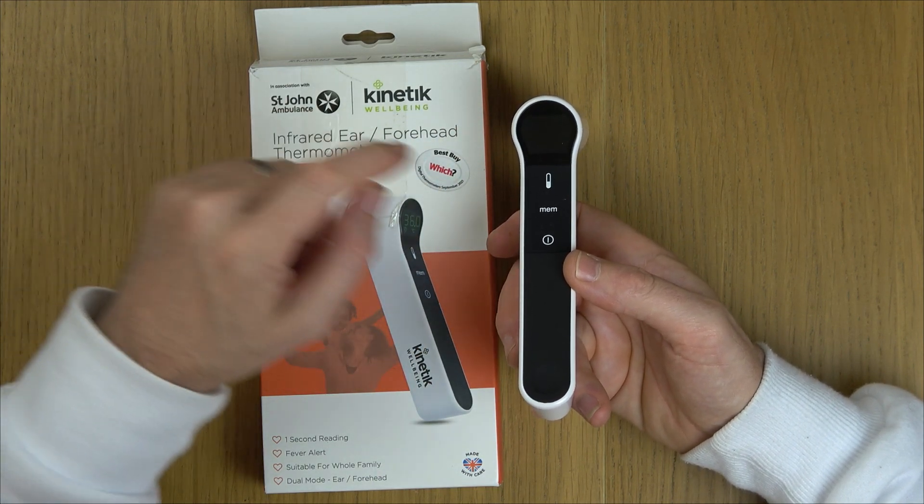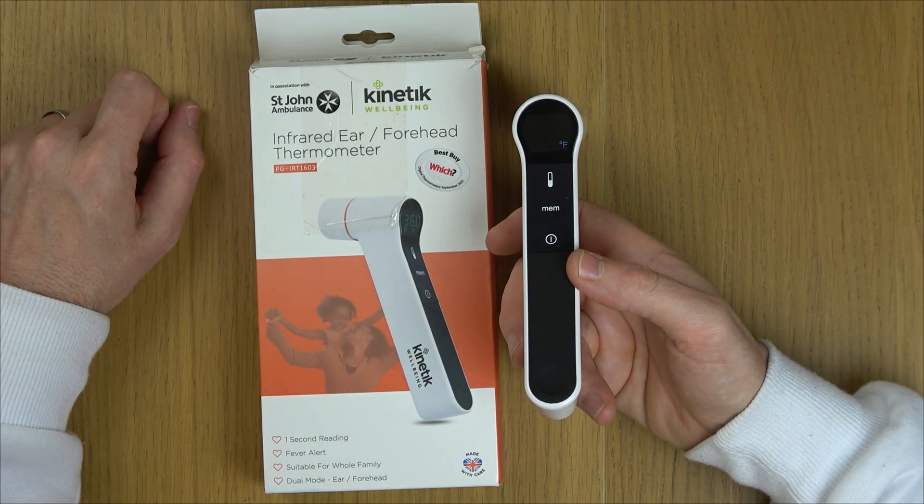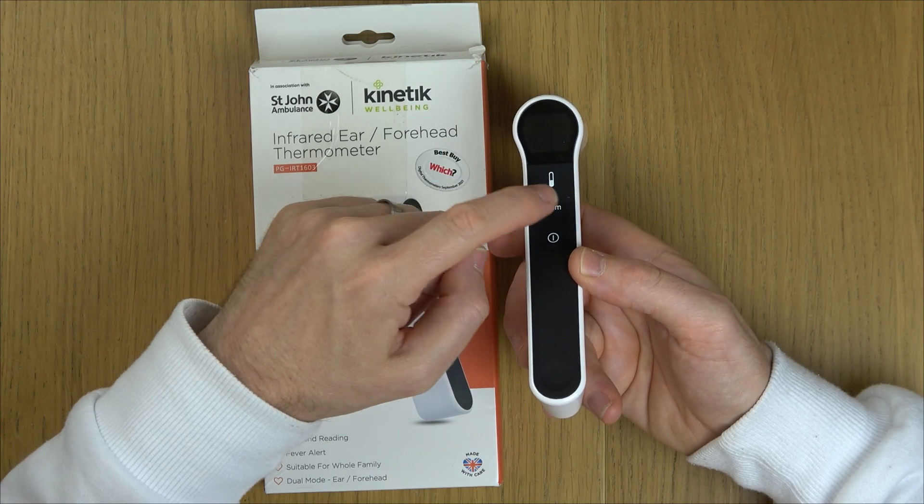So if I want to change it to Fahrenheit, I need to hit the memory button again and it will go to Fahrenheit. You can see every time we press it, it will change between them.